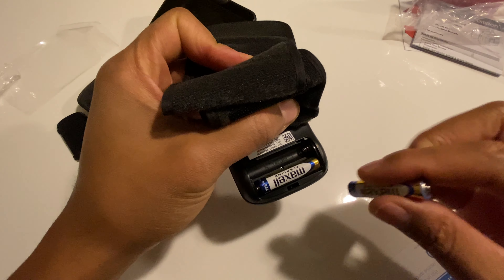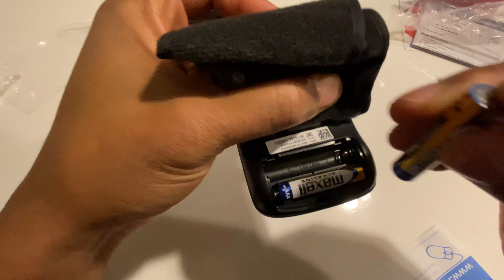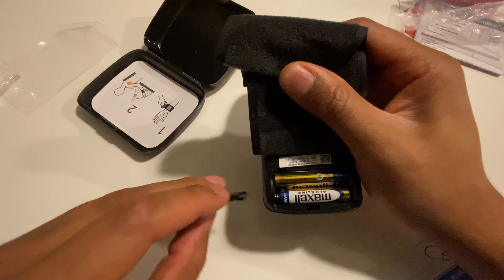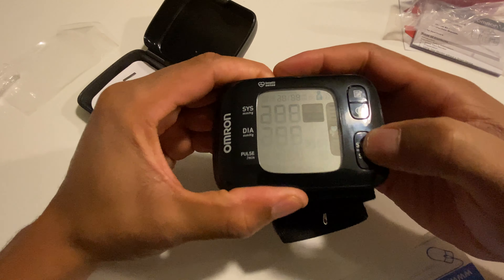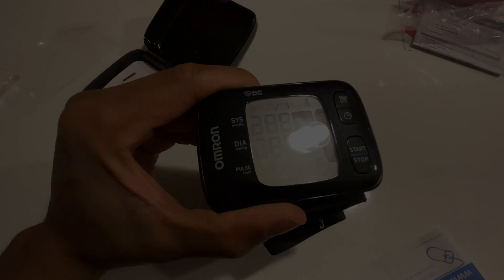I'm putting the batteries in with the end that sticks out away from the spring, as you can see right here. Then I put the batteries in and replace the clip onto the back of the blood pressure monitor cuff. As you can see, it has powered up and is asking me to enter in the date.